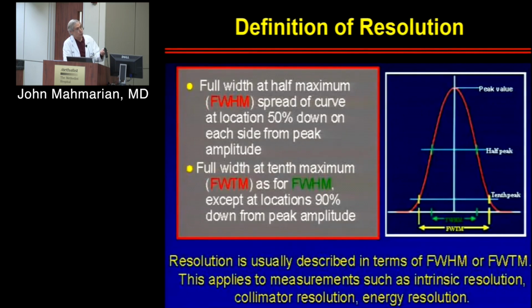If you have a point source here, you're going to get a spread of what that image would look like. So what that point source would actually look like would be this width. This is the full width half maximum. It would not be just a single point. It would be something wider than that, and that's determined by the full width half maximum.